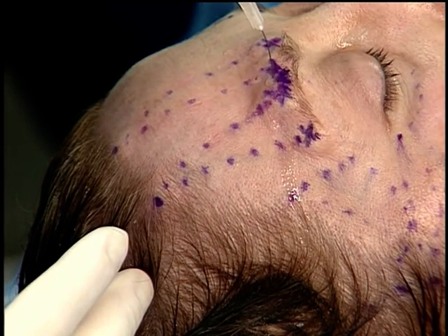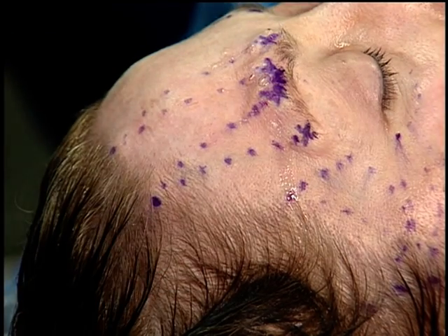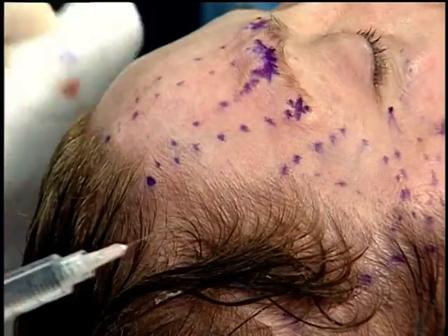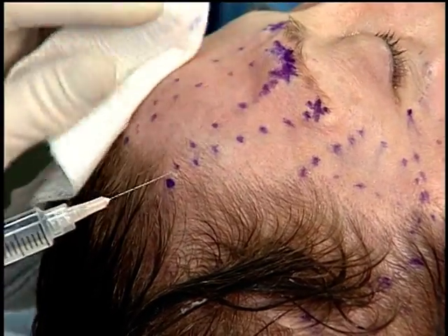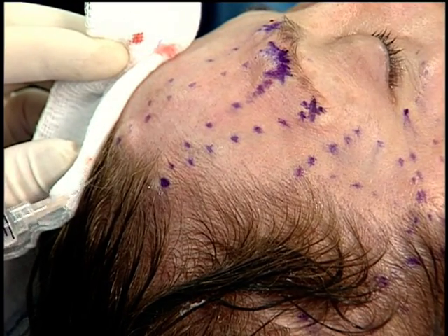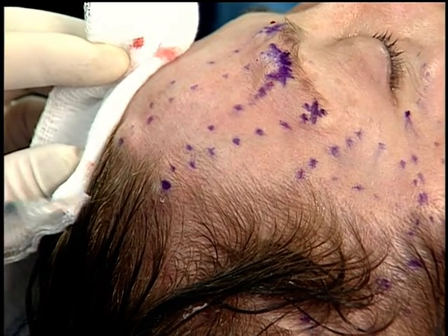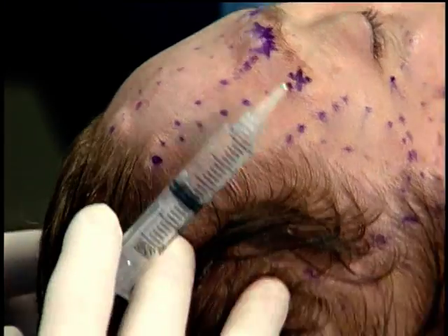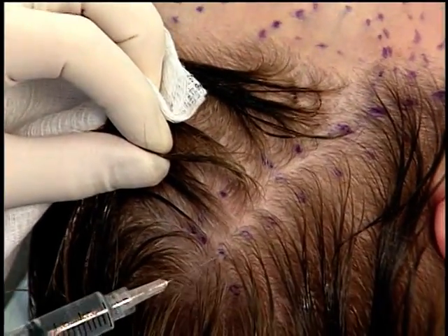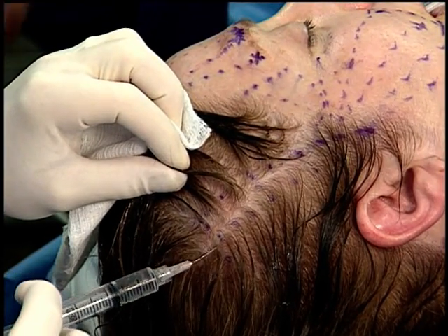I then do a supraorbital block and a supratrochlear block because we're going to be dissecting some of that forehead off. The type of anesthesia I normally use under local would be one 10 milligram tablet of Valium about 1 hour before and a Vicodin about 1 hour before. This provides a nice sedative effect, and usually patients can get through that very nicely. I then go through the rest of the scalp doing my intradermal anesthesia with this 5 cc syringe. Most patients have their Vicodin and their Valium circulating.